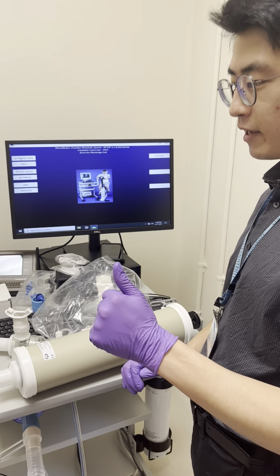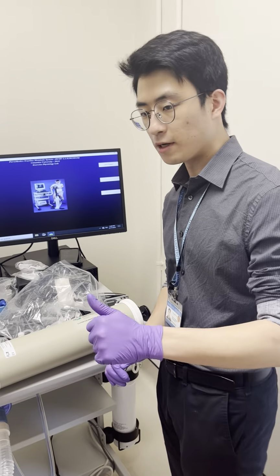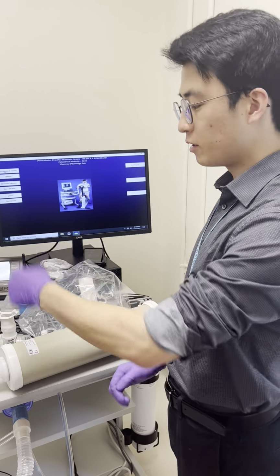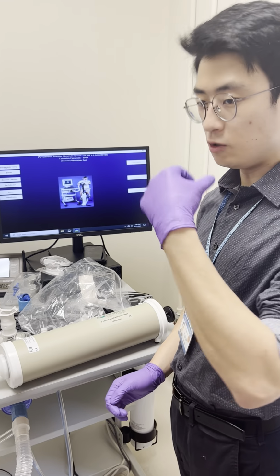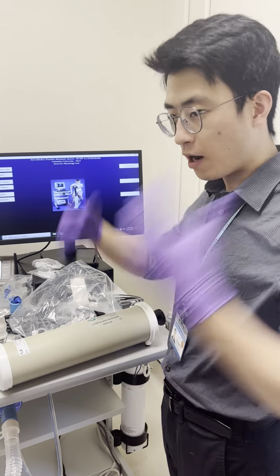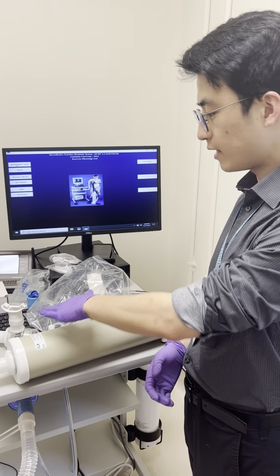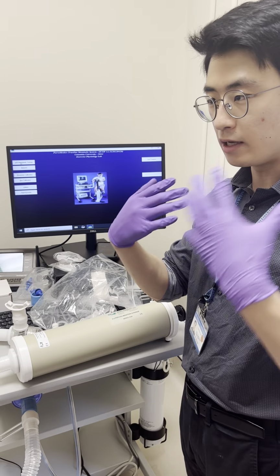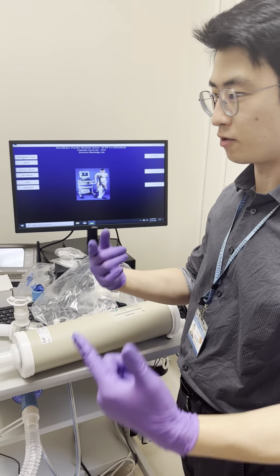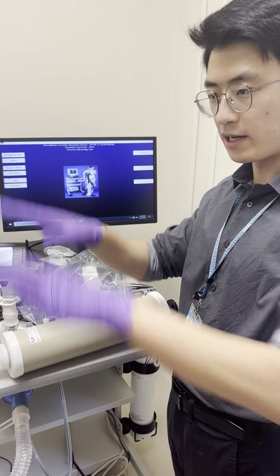Last thing you should probably have on hand before the test begins is some water. People will come in, and their mouth may be really dry. One thing to note is that when you put the nose clip on, you can't swallow spit, or you can't do it well. It'll pop your ears, and they might drool into the device, and when you're breathing in without swallowing your spit, it'll dry out your mouth, it'll dry out your throat, and you have to do this for about 24 minutes, or a little longer than that, with the resting period and everything.